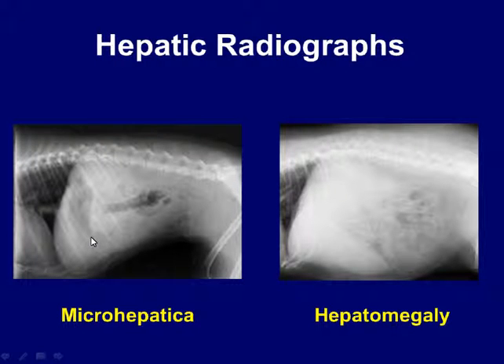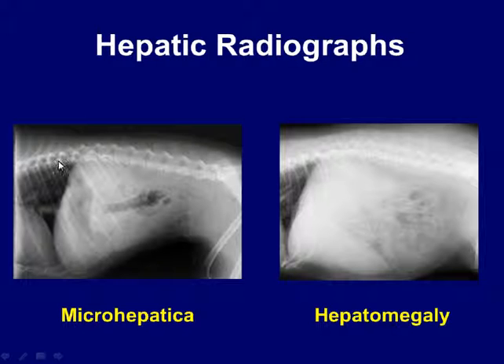We can see the gastric shadow here — we have air in the stomach. We have the edge of the diaphragm here, and we can imagine that the stomach is pushed forward. If you draw a line from the vertebra down, you can see that this line would be pushed forward.